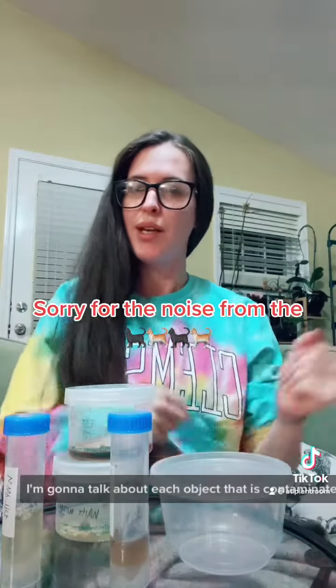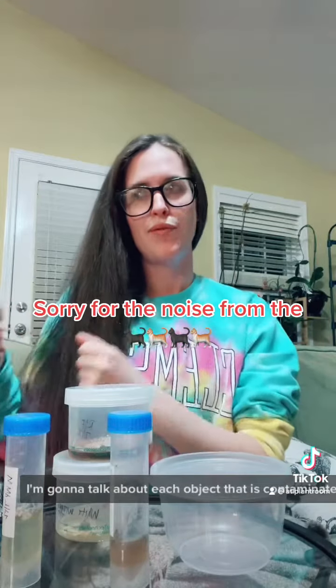I already hate my first video so we're making another. I'm going to talk about each object that is contaminated and how to fix it.